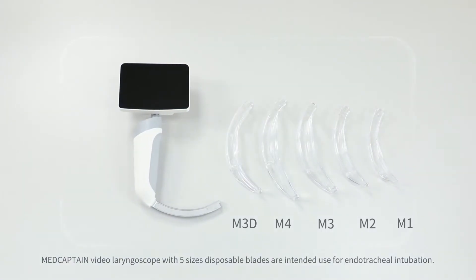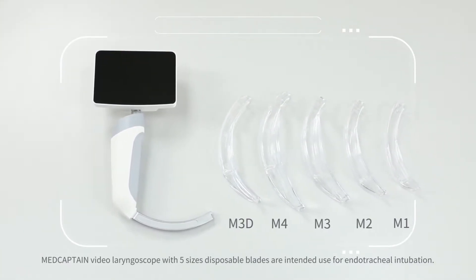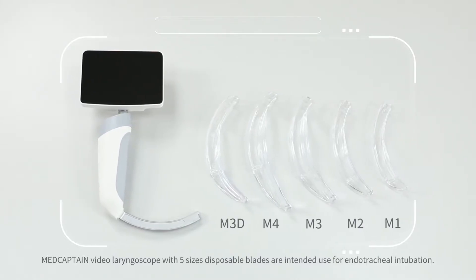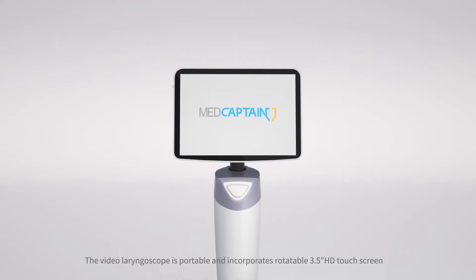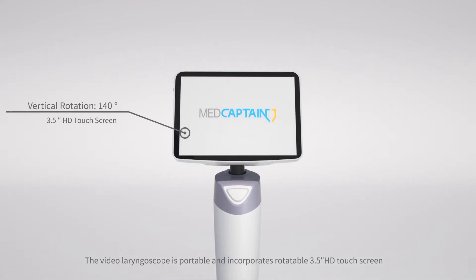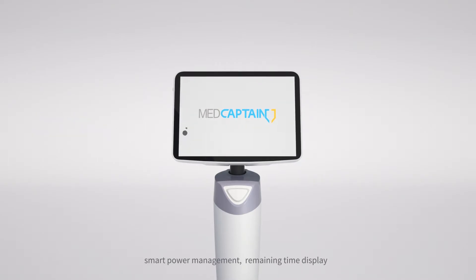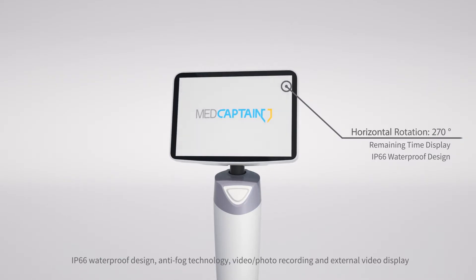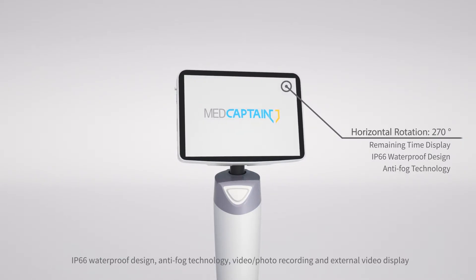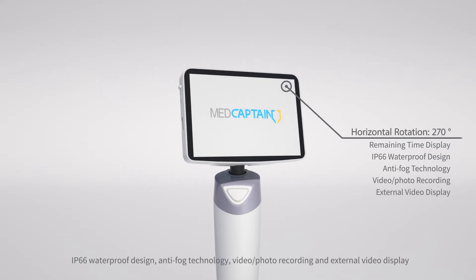MedCaptain Video Laryngoscope, with five sizes of disposable blades, is intended for endotracheal intubation. It is portable and incorporates a rotatable 3.5-inch HD touchscreen, smart power management, remaining time display, IP66 waterproof design, anti-fog technology, and video and photo recording with external video display.